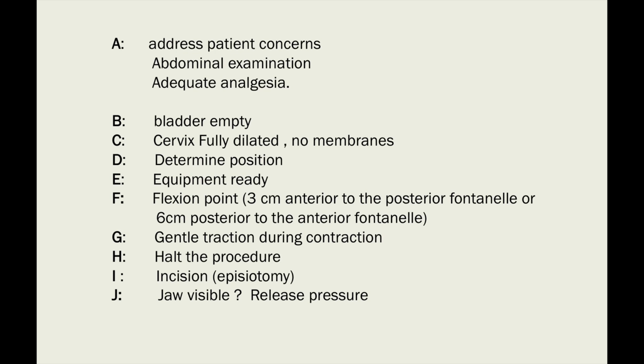Yes. Okay, do you have any questions? No. Okay, now we are going to demonstrate whatever we told about the procedure on a mannequin doll. I will show you exactly where the flexion point is and how to put the cup on the center of the flexion point. After that, I'm going to give you a feedback form. If you please fill in that feedback, just for me, to improve my teaching and to learn more about my teaching skills. Is that okay for you? Yes.